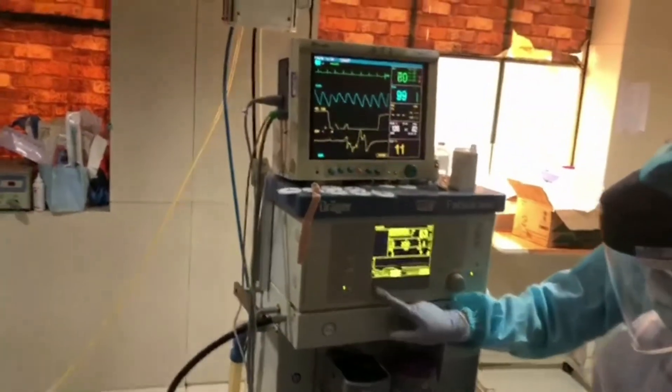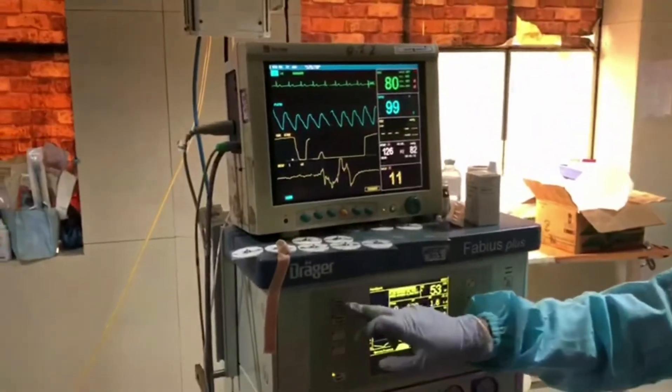The patient was comfortable throughout the procedure, and as we see on the monitor, the vitals of the patient were normal throughout.